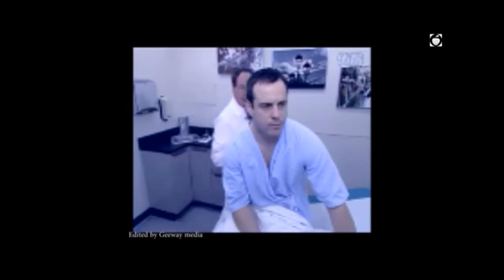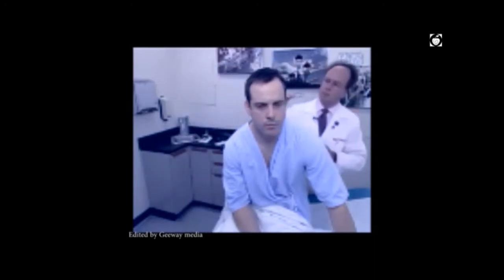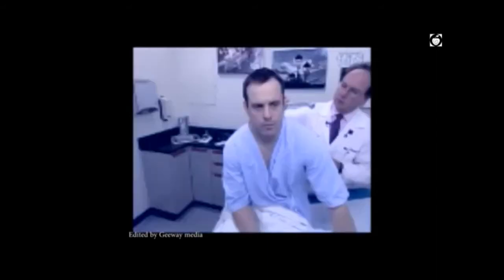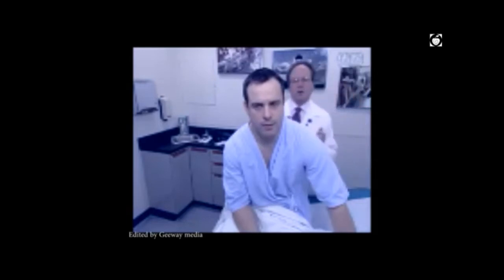Repeat the Rinne test on the other ear. Ask the patient when they stop hearing the vibration on the mastoid, then move the fork in front of the canal — if they can still hear it, air conduction is again greater than bone conduction. In this patient, air conduction is greater than bone conduction bilaterally, which is normal.